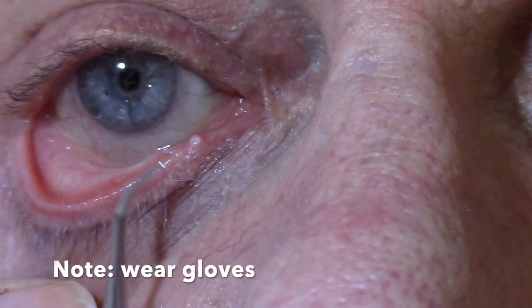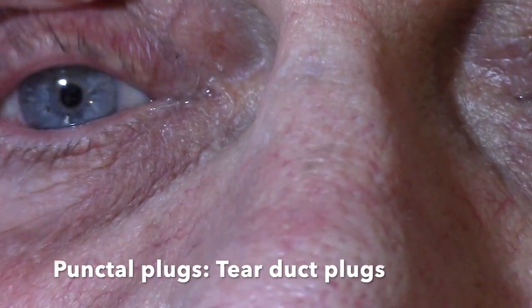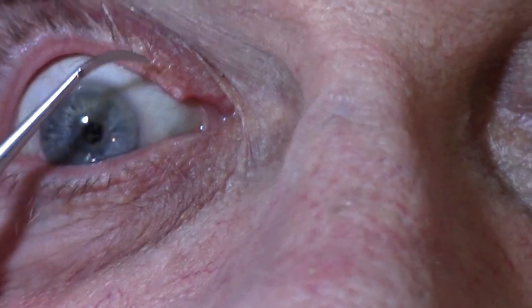Let's take a look at what Jim recently had done. Jim, you want to tell us what these are? Those are plugs in all four nasal lacrimal ducts that were placed there because of excessive dryness of the eye.